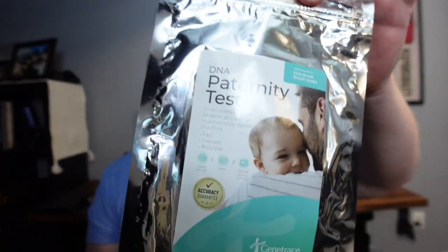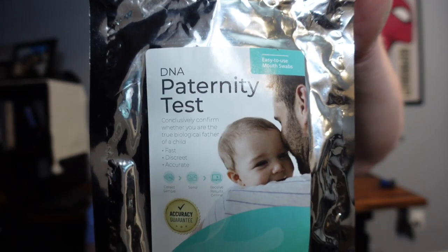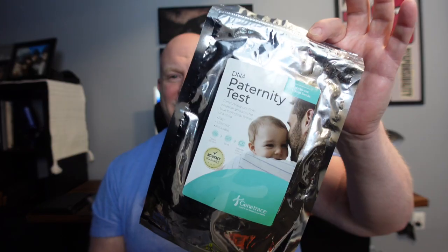I just want to do a quick review of this paternity test I recently picked up. If you want some peace of mind, definitely take a look at picking this up. If you're not sure about getting this sent to your house, no problem — just send it to one of the Amazon Prime lockers and you can pick it up there.